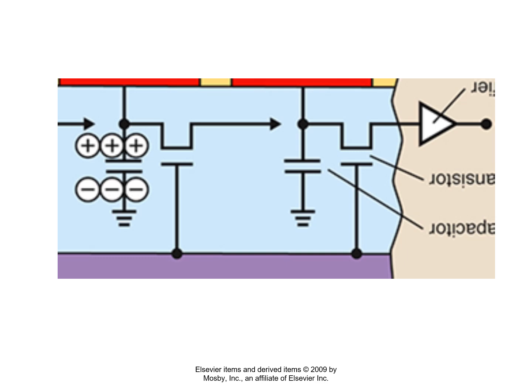So those positive charges won't move until the next device over to the right, which is the transistor, offers a greater negative charge than the ground is offering. Okay? The ground is only offering a balance of charges, okay? Because that's all the ground will ever offer.